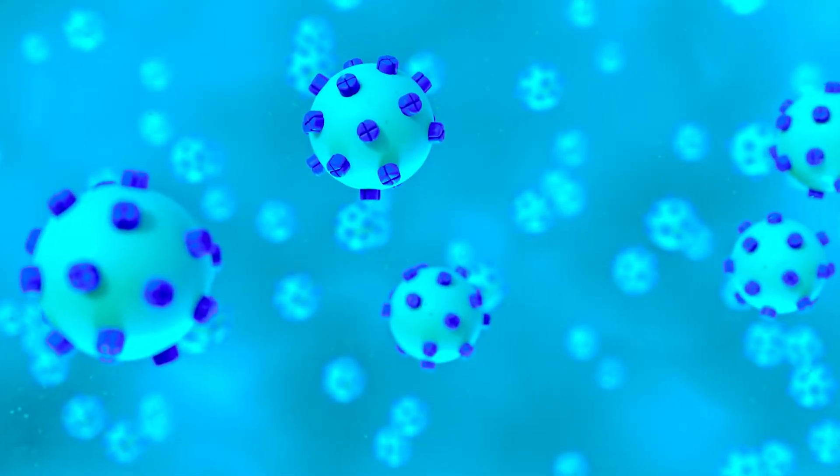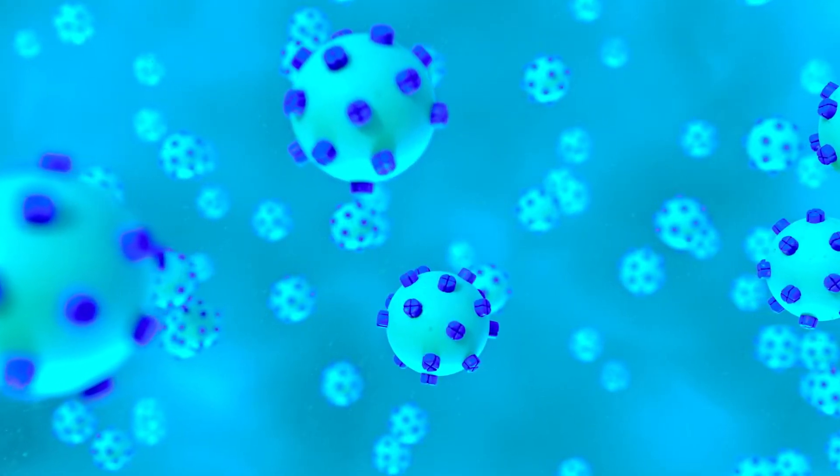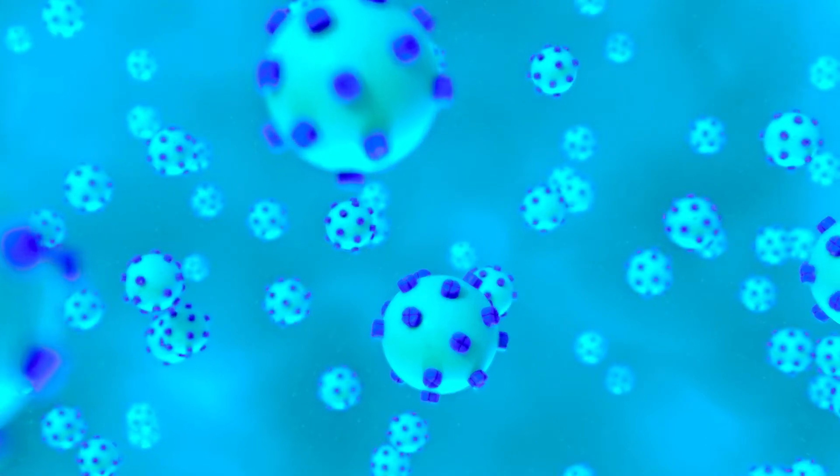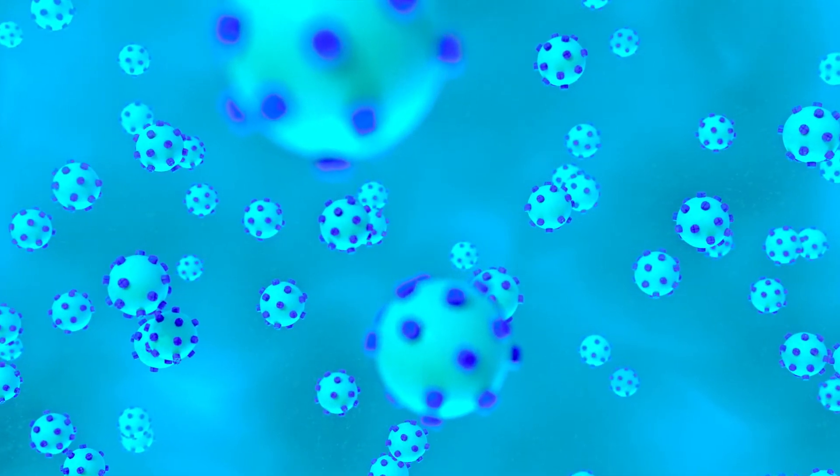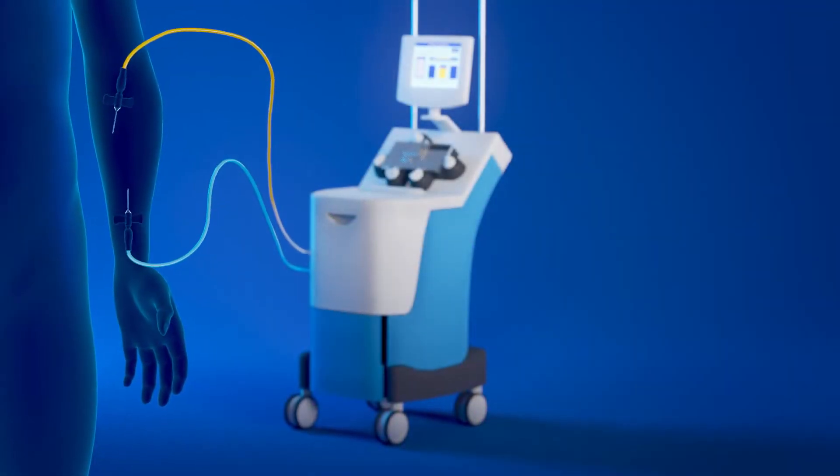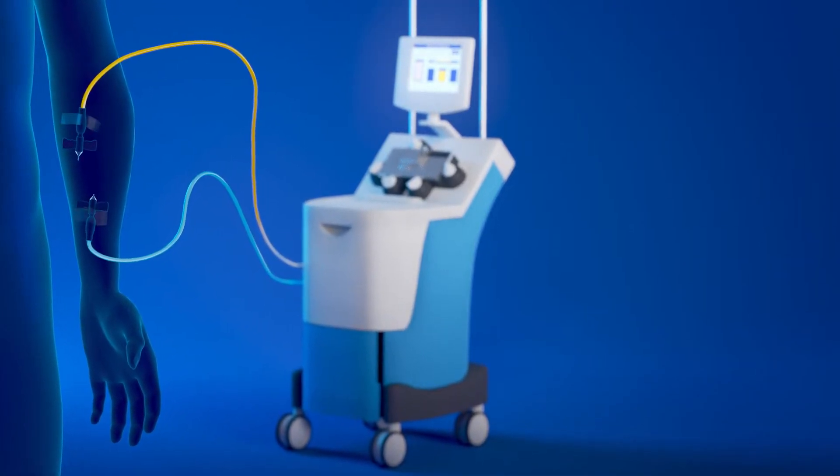The filtration system relies on biocompatible, highly porous resin composed of sepharose beads conjugated to the histone H1.3 protein, an ultimate human DNA binding protein.